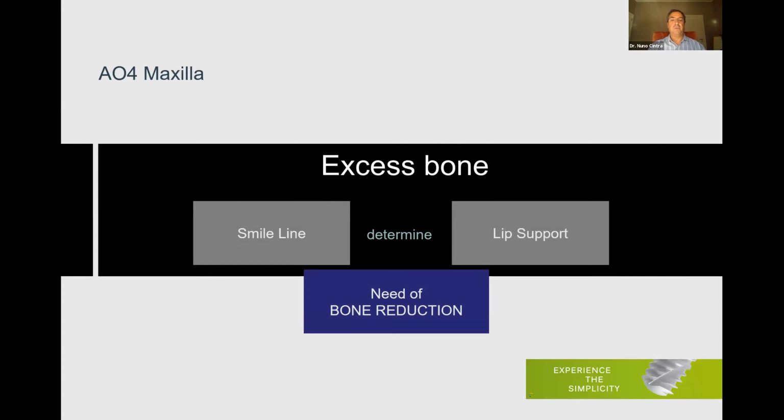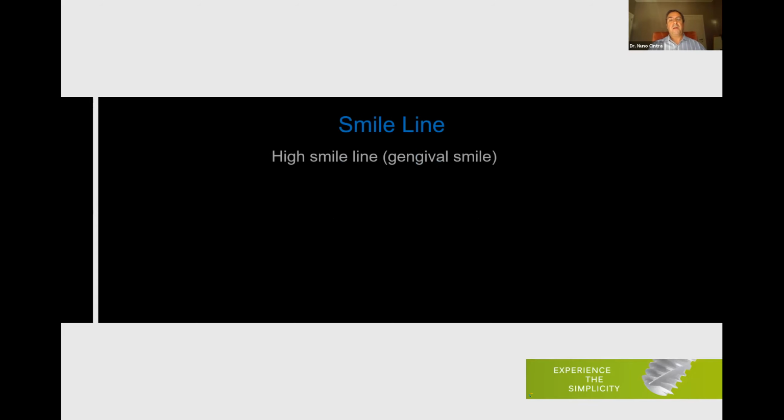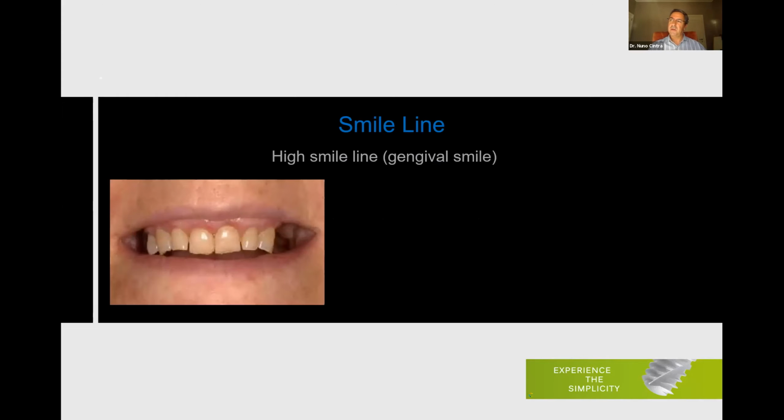Now, bone reduction. I know this is an issue that some of you don't like, because nowadays we talk in the opposite direction. We talk about bone augmentation. But remember that mainly due to these 2 points, the smile line and the lip support, in most of the cases, we need to do bone reduction. For instance, the smile line, as you know, we have 2 kinds of smile line. We have the high smile line, or gummy smile, or we have the low smile line, where the patient doesn't show any gingiva when he smiles. If we have a high smile line, the so-called gummy smile, we can deal with that in 2 different ways. For instance, a situation like this one.